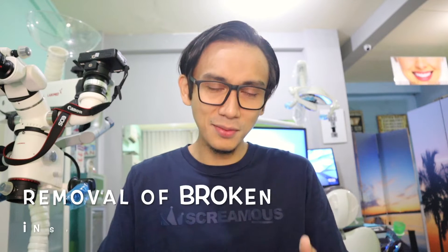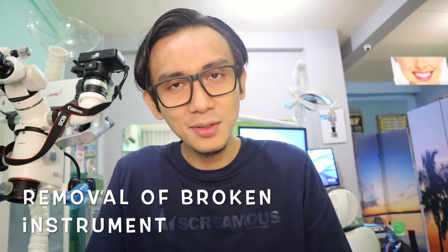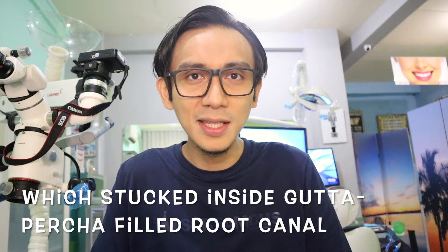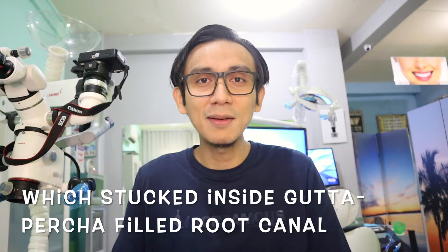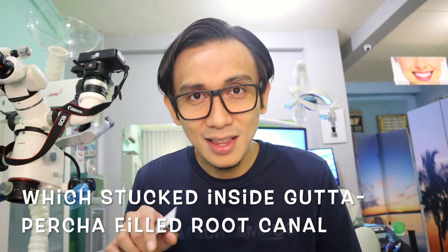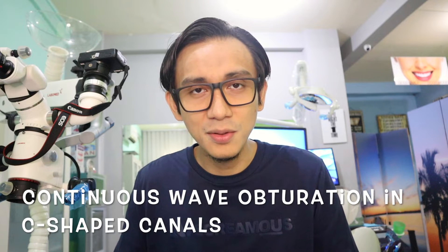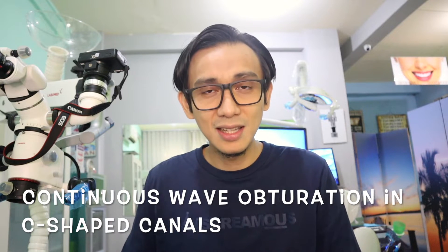In this clinical case video, I'm going to show you how to remove a broken or fractured file inside the root canal that has already been obturated by a previous operator. Then, in a single visit, I did a continuous wave obturation using bioceramic sealer.